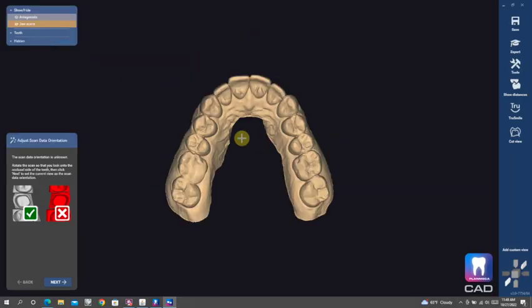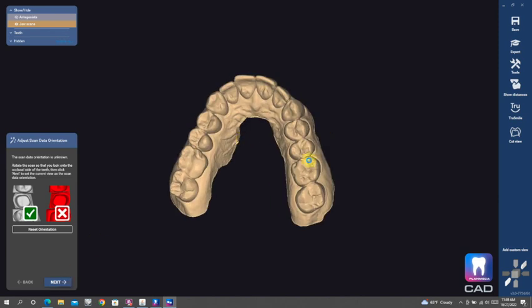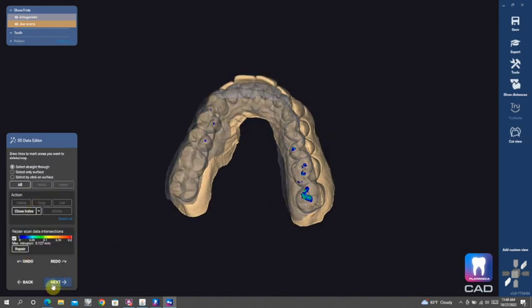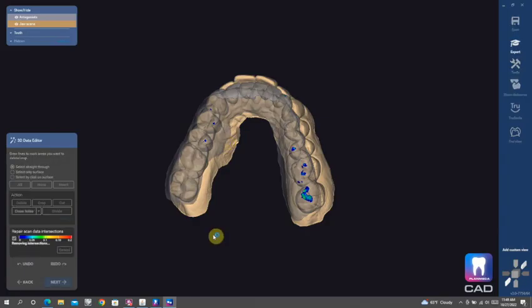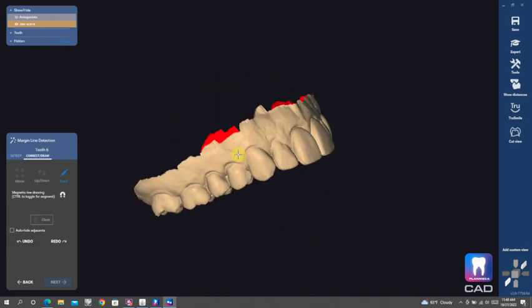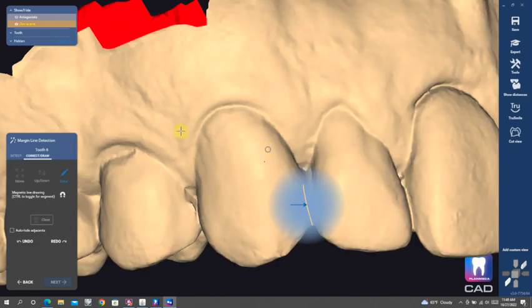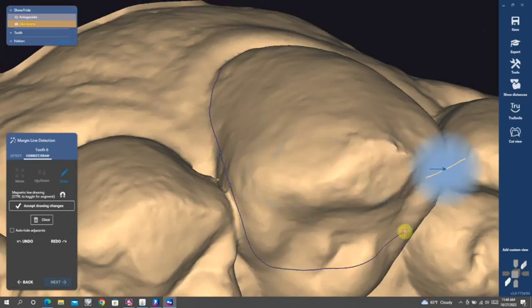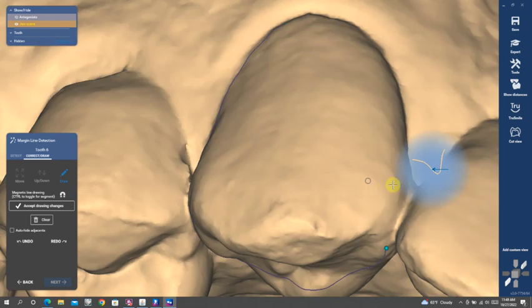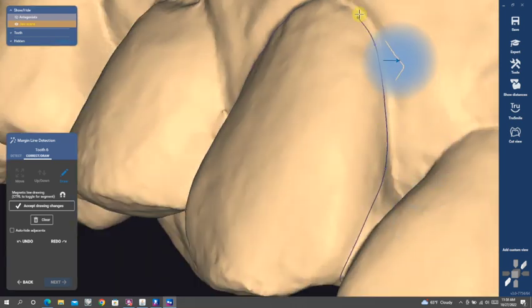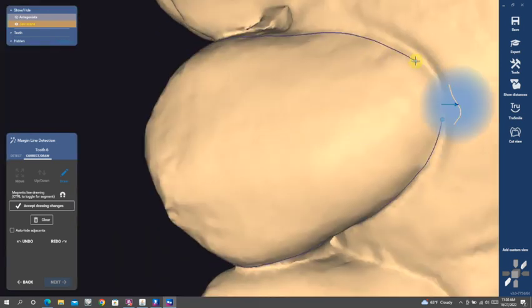That's basically how far from your finish line the cement gap begins. So getting started, we're just importing our scans. I did this on myself. And as I'm marking a margin, I'm doing it kind of like a crown and I'm trying to tuck those finish lines into the embrasures a little bit.